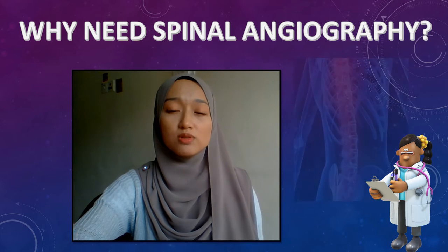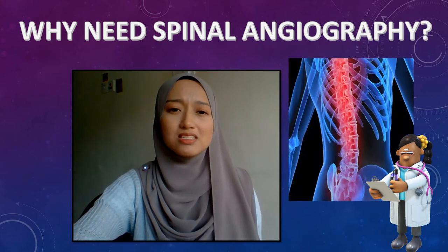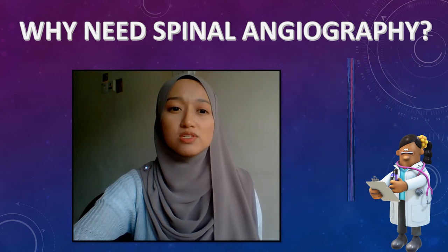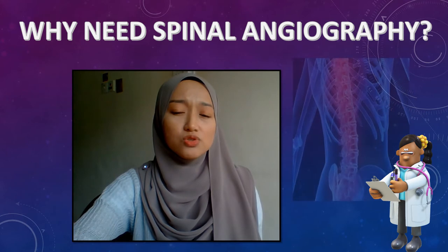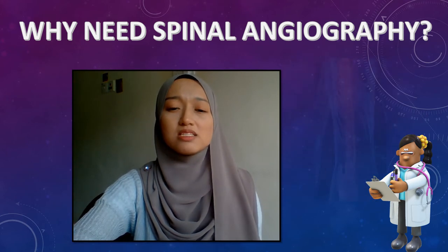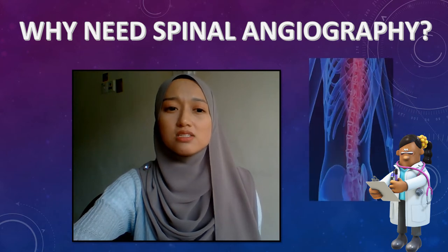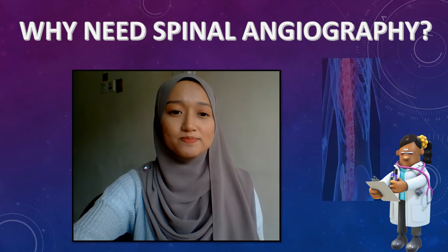Based on the results of the angiogram, your surgeon can develop a plan to safely remove your spinal tumor. Sometimes during the angiogram, the neuroradiologist can block some of the big tumor vessels to reduce bleeding during the surgery. This is usually discussed with you before proceeding, but is common in certain types of tumors, such as those that travel from the kidney to the spine.